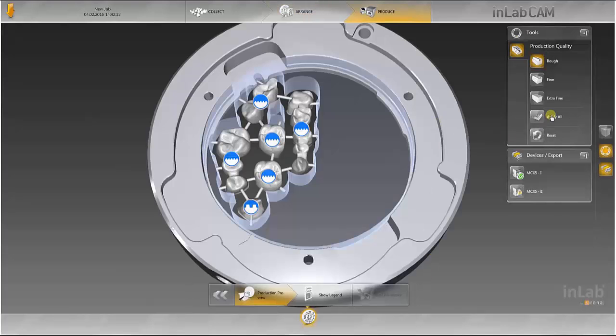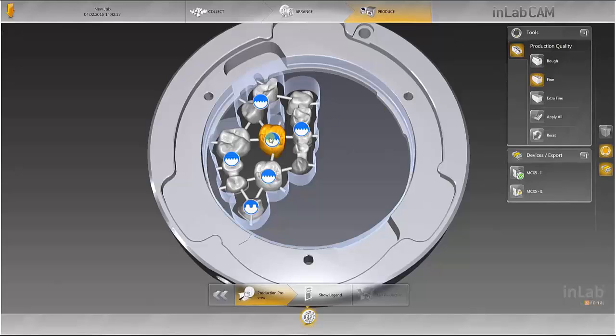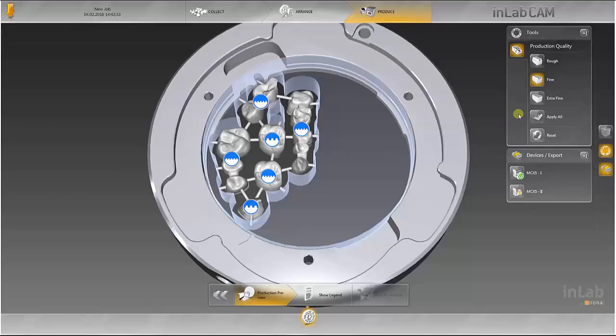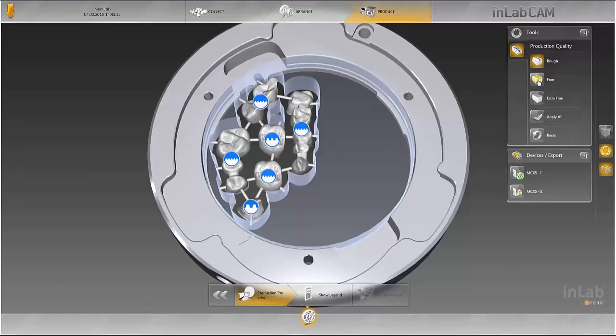Next, select the production quality of the outer surfaces of each restoration. Areas which have been reduced can be finished with a fine or rough quality. The highest extra fine quality setting is recommended for full contour work.